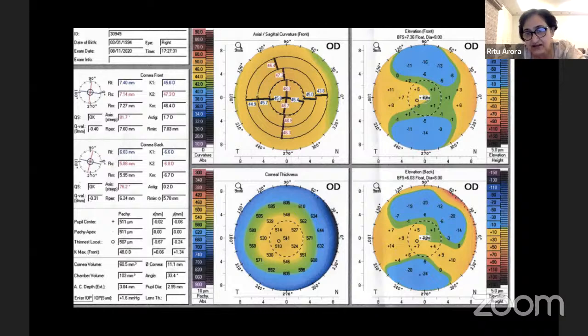Come on, Anil talked about it, the scale. If you look at the left side, the thing is that the scale is varying by 2 diopters. All the values are within this given range, within 2 diopters, while above, of course, it is 10 diopters on those colors. So if the variation is within 2 diopters, it's going to show you the same color. Always, before you interpret, look at the scale. If the variation is within 0.5, it will magnify even a small difference.